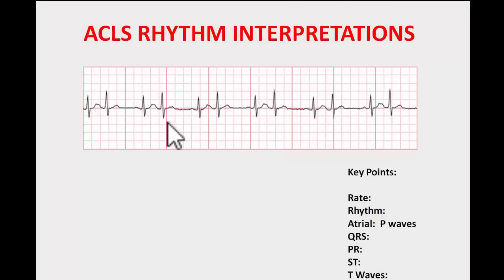Here is an example which is like a normal beat, an atrial premature beat. This is an atrial bigeminal rhythm, which is a little more advanced. That's why I said we need to be observing these irregular heartbeats because they can progress to more serious types of rhythm problems such as atrial flutter or fibrillation.